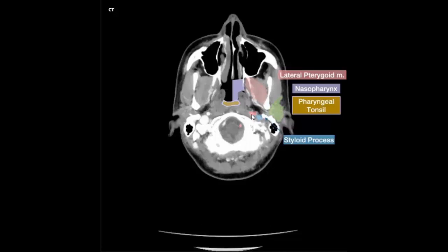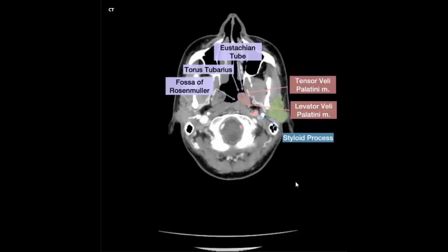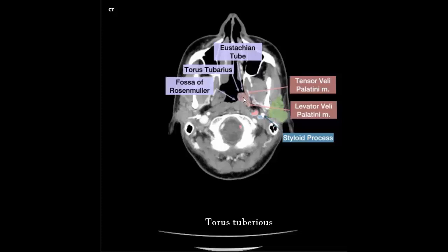Internal carotid artery, jugular vein, styloid process, right and left vertebral artery. Fossa of Rosenmüller, torus tubarius, Eustachian tube, tensor veli palatini muscle, levator veli palatini muscle.